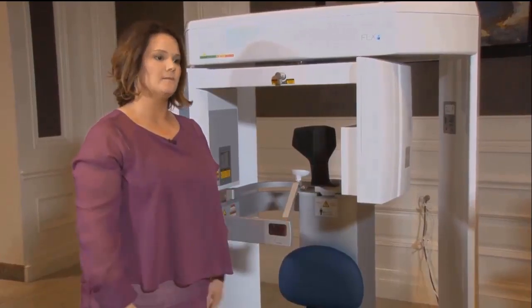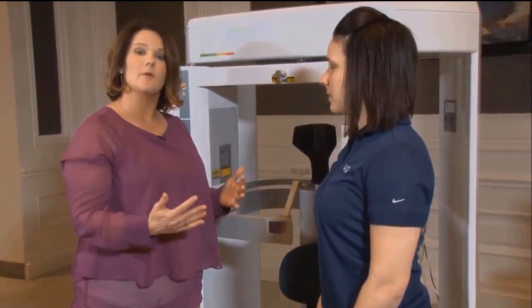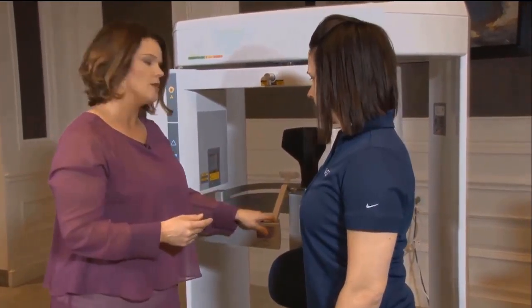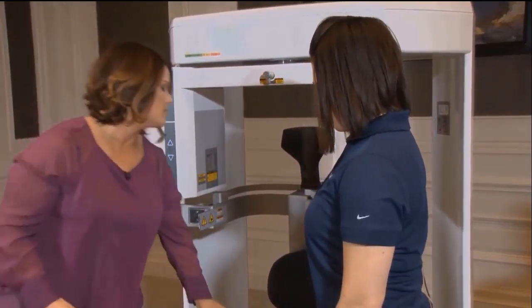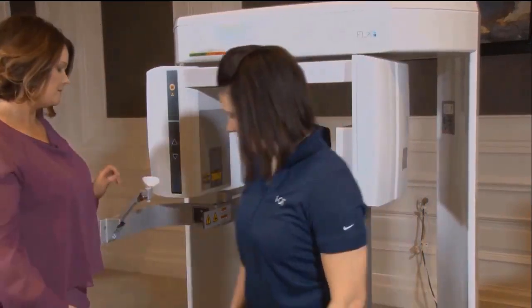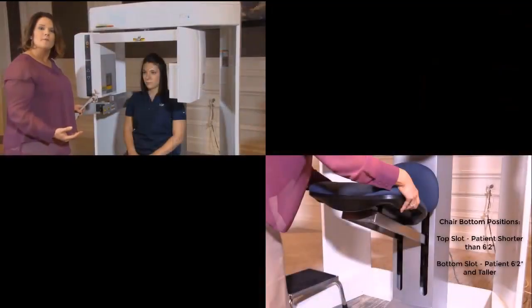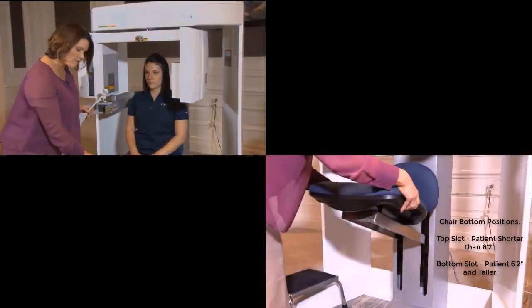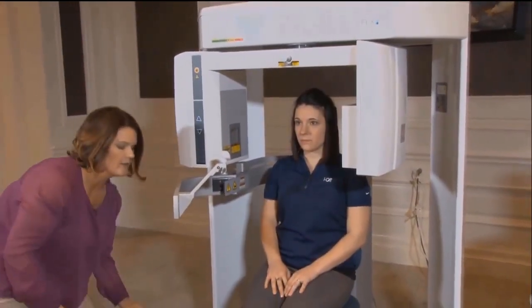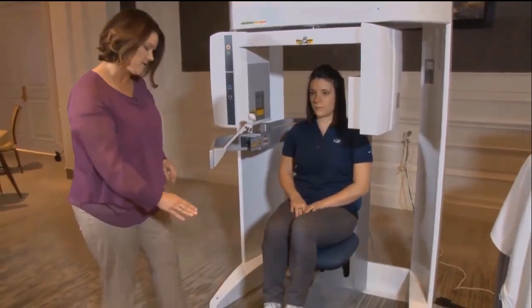We're going to use our patient. First thing we want to do is let them know that we're going to be moving and positioning them, so they're aware if we're touching or moving them. I'm going to open the gate and let my patient know to scoot all the way to the back of the seat and lay her head in the headrest. The most important part is stability, so we want to make sure if the patient's feet are not flat on the ground that we stabilize them with our footstool. I'm going to bring the footstool right around and have her place her feet right there.